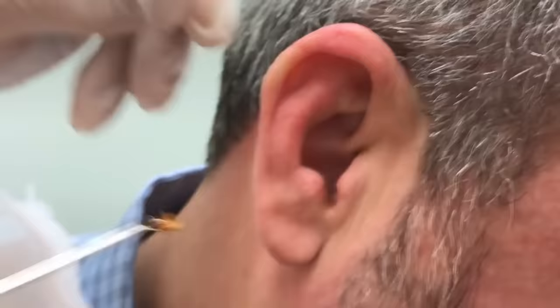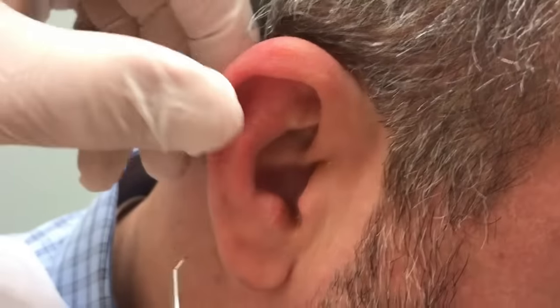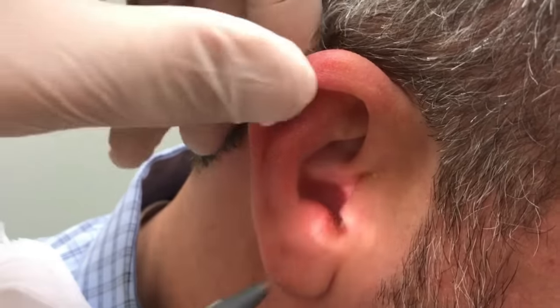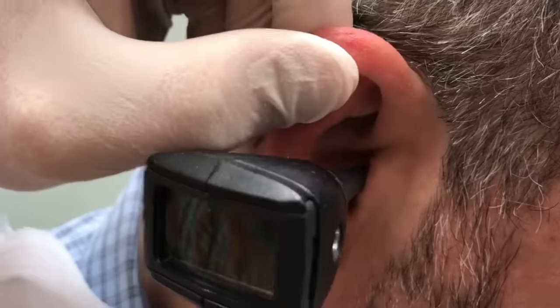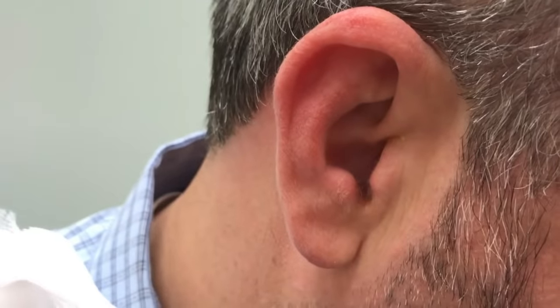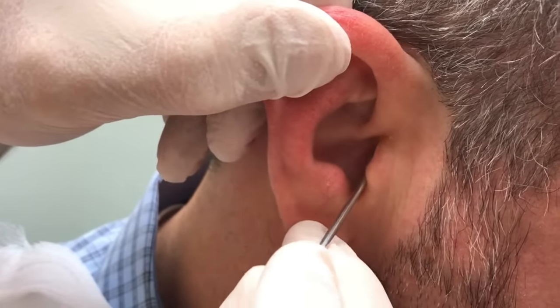Look at that! We've got one big piece — there you go, don't look, I'll show you if you've got to see it. Take another look in there. How did that feel? It feels better. Already noticed an improvement there? Alright, we're going to get back in there real easy.